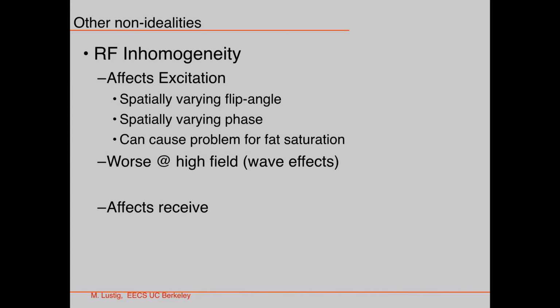Well, there is a possibility. If you, for example, do Z gradient encoding, that's one way. But this kind of becomes 3D, like 3D with spaces. Let's say I have a volume and I excite this slice and this slice in the volume, and the rest is going to be black.